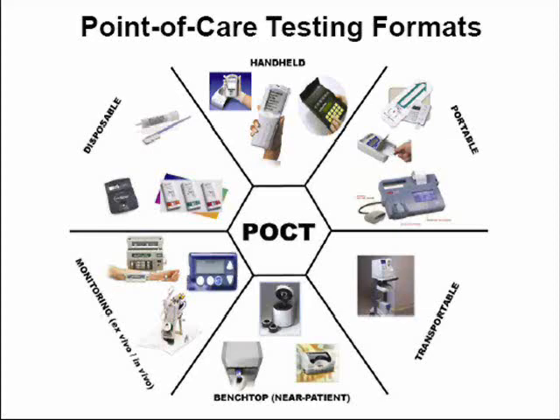Continuing on, we have benchtop devices. This is a subcategory of the transportable devices group. They are just shown here to give an overview of the diversity within this point of care format category.